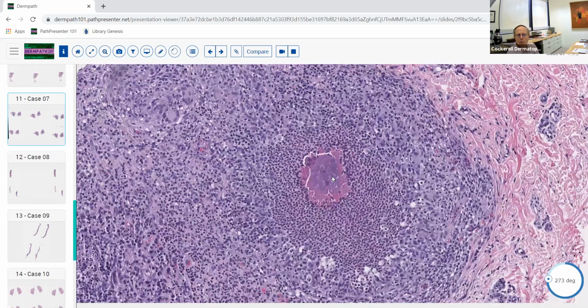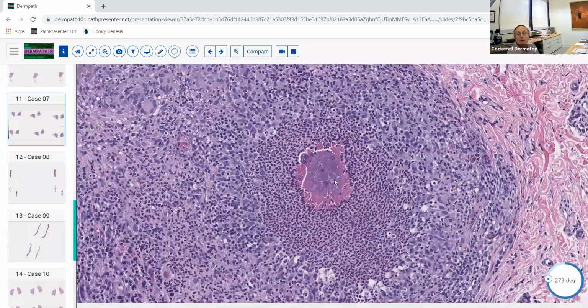I don't know that the board examination would show you a grain just like this and say, okay, which organism is this? If they showed you an obvious GMS stain that was positive, and you see hyphae in there, you could call it a mycotic grain. If you had an AFB that was strongly positive, you know, call it nocardia. This was a patient that we thought actually had nocardia in this case, and it was very weakly AFB positive.